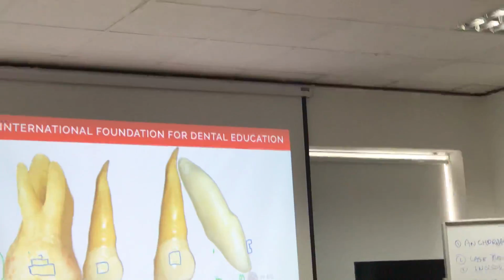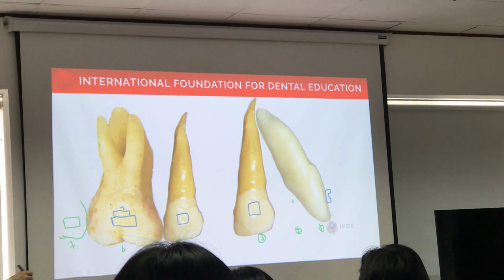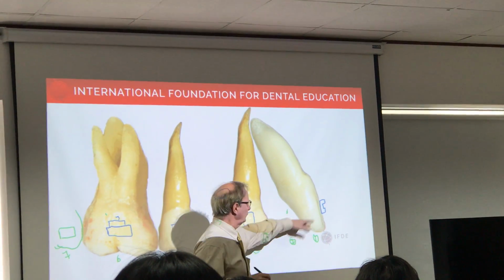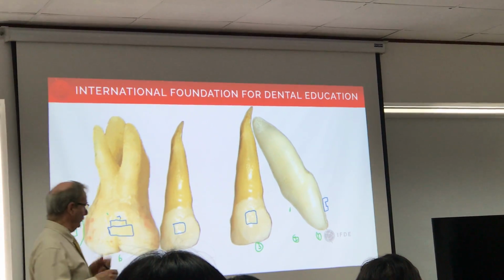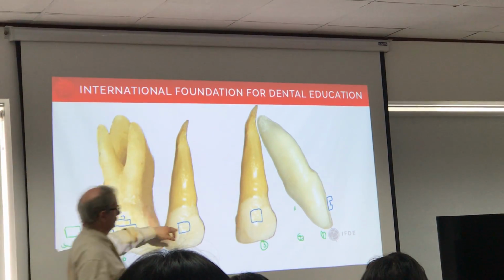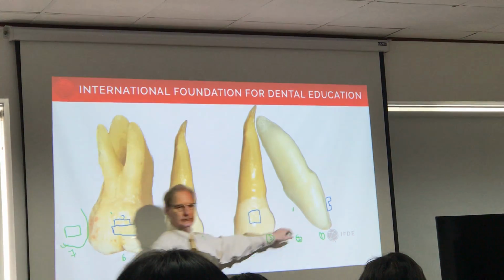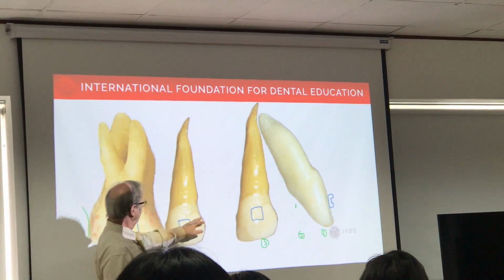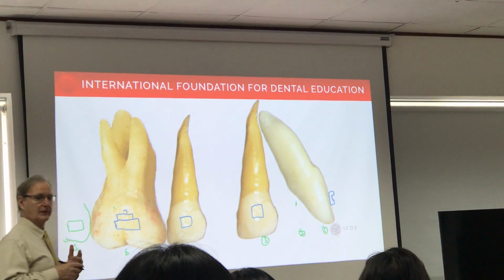Okay, so now you have this situation, right? You have intruded incisors, probably the 1 and the 2. You're pretty happy, this will be too high, but we don't discuss that. Let's assume it's good. So now you are into either the straight wire well, because you can really make a nice wire straight, or you can do a closing loop, we'll talk about, but you have many possibilities.